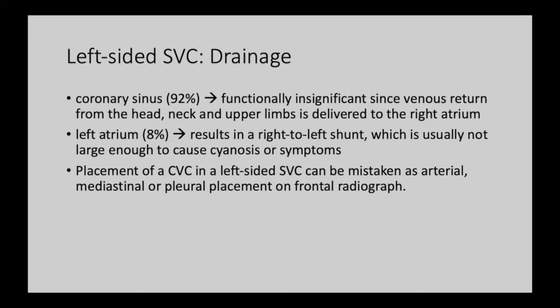Placement of a central venous catheter in a left-sided superior vena cava can be mistaken as arterial, mediastinal or pleural placement on frontal radiograph.